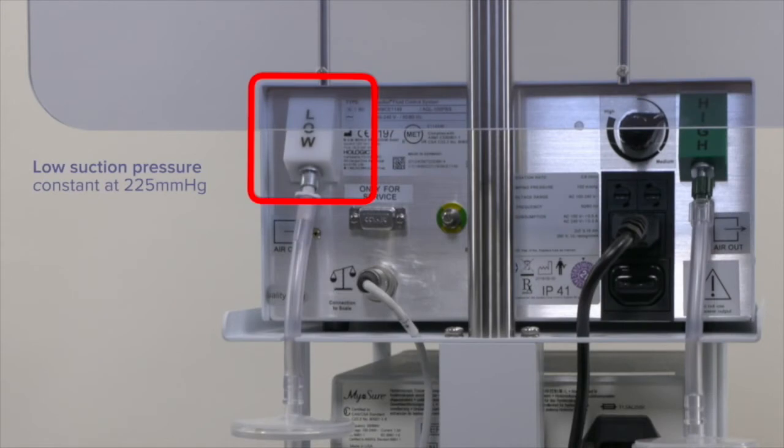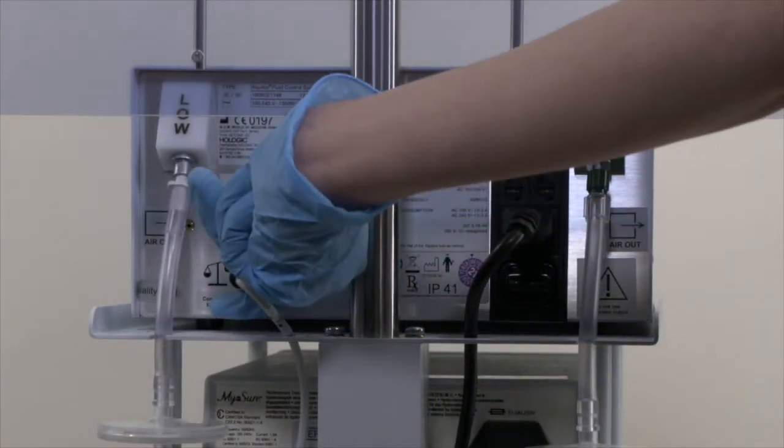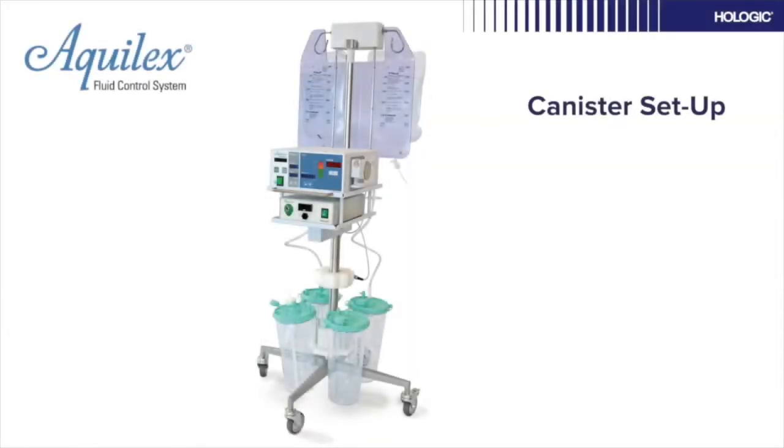The low suction pressure is set to 225 millimeters of mercury, constant pressure. The high suction pressure is adjustable up to 500 millimeters of mercury by rotating the dial and can be utilized during a MyoSure procedure to improve cutting efficiency. Check the scale connector is secure and finger tighten. We are now ready to set up the canisters.